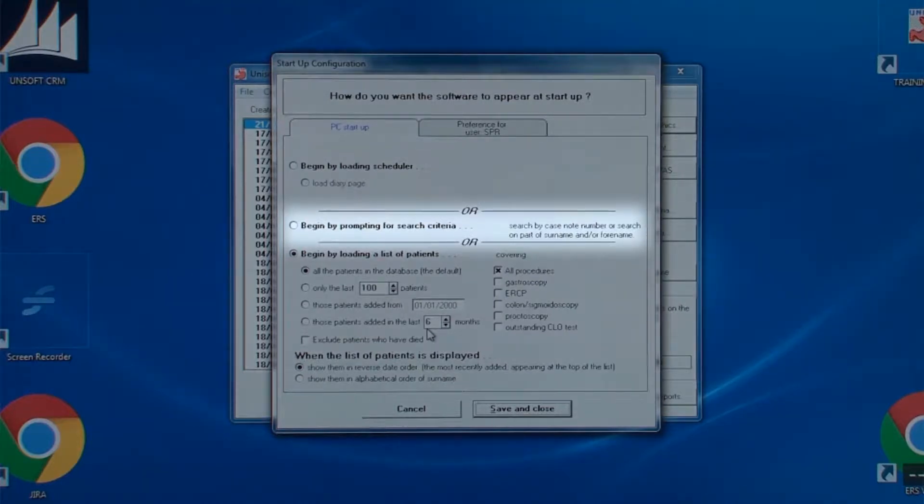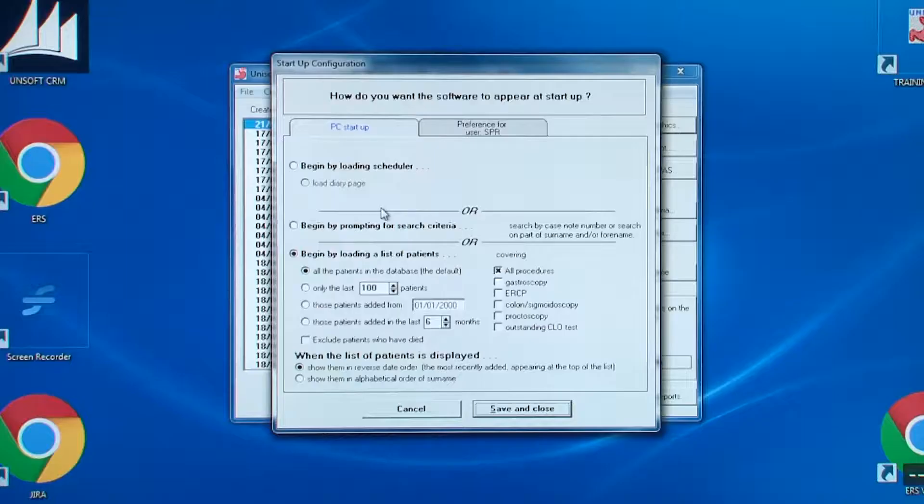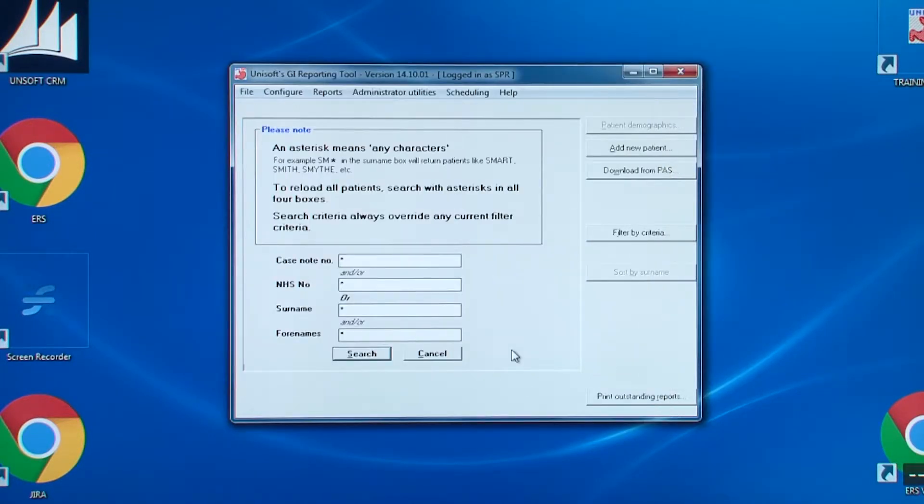If you have the scheduler enabled you will see this option. You can automatically have the diary page for today being displayed for endoscopists to work off their work list. So here's what the opening screen looks like when you choose begin by prompting for search criteria.